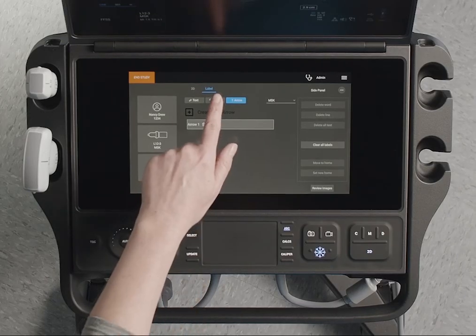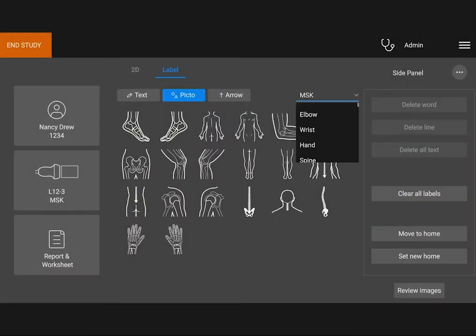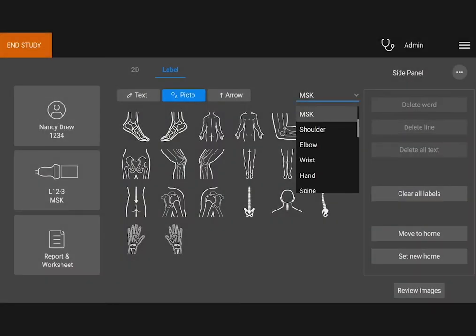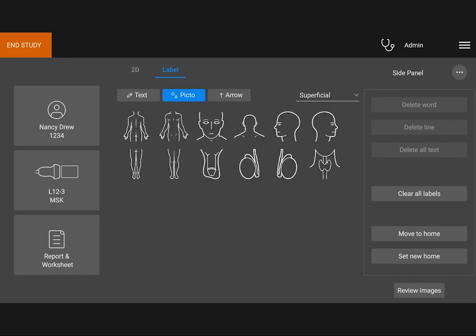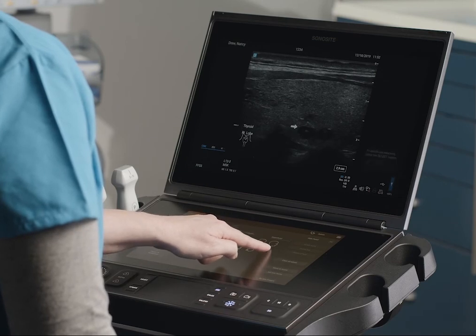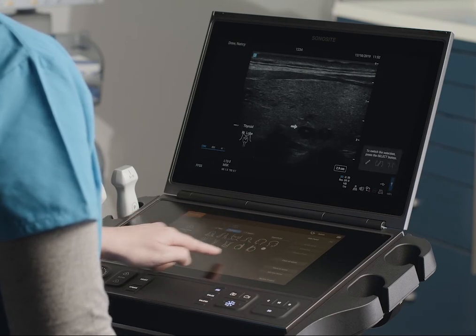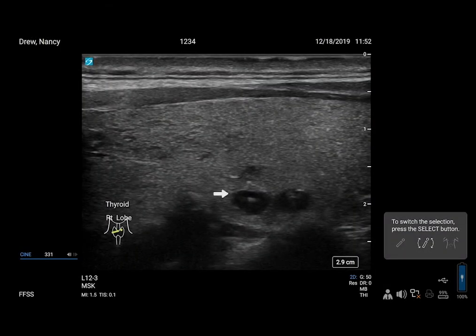To add a pictograph, tap Picto. The pictographs available on the screen depend on the exam type you are currently in, but you can always choose a pictograph from the menu. You can place the pictograph in various positions. Each pictograph comes with a transducer orientation marker. Rotate the marker to indicate the orientation of your image on the pictograph.